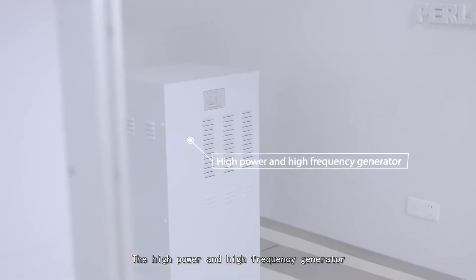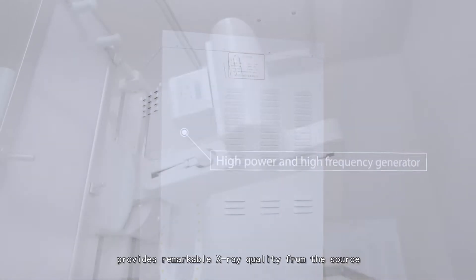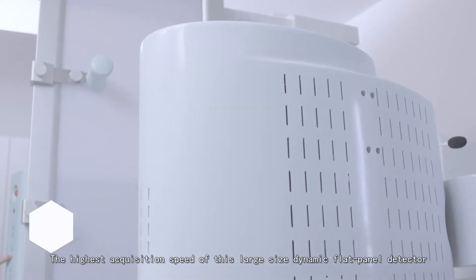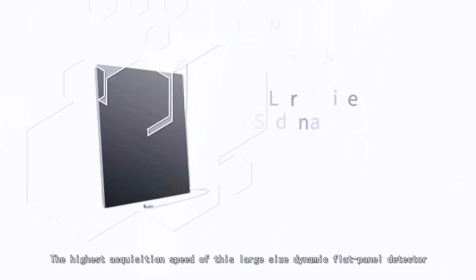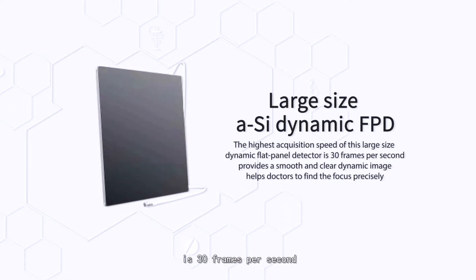The high-power, high-frequency generator provides remarkable X-ray quality from the source. Large heat capacity of the X-ray tube promises longer workflow. The large-size dynamic flat panel detector achieves 30 frames per second, providing smooth and clear dynamic images that help doctors locate the focus precisely.